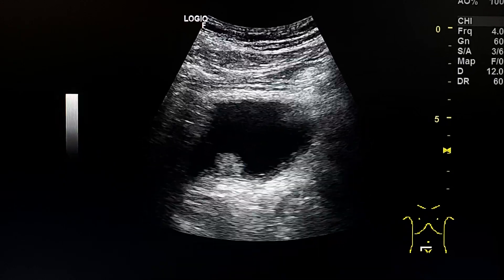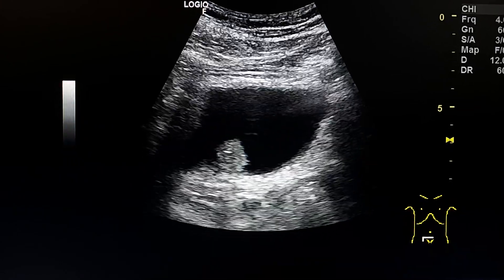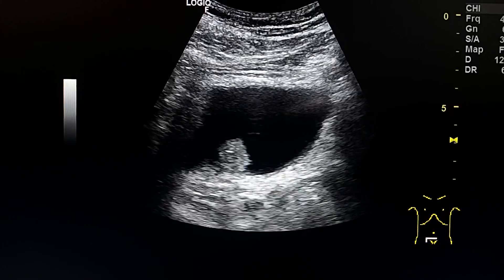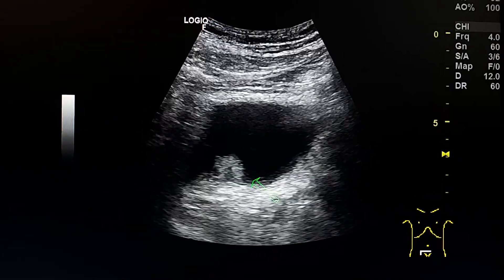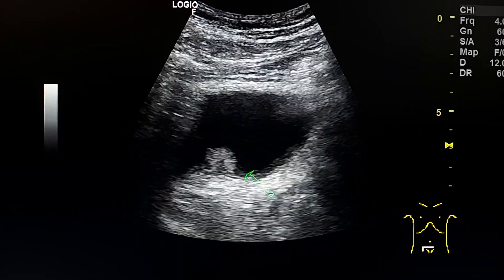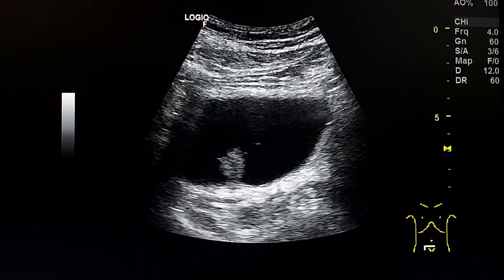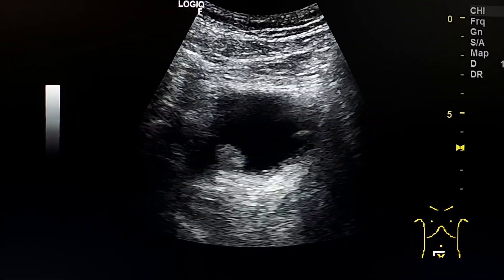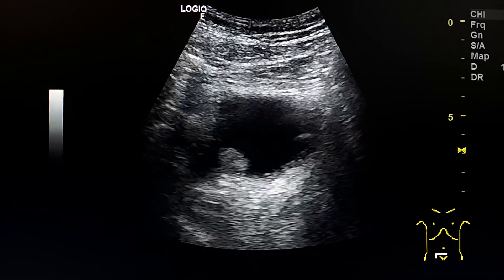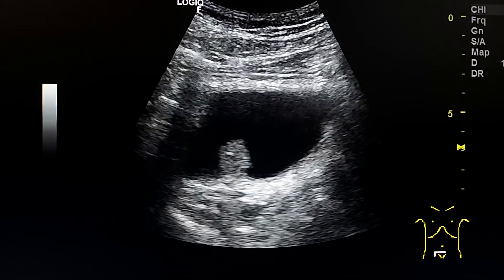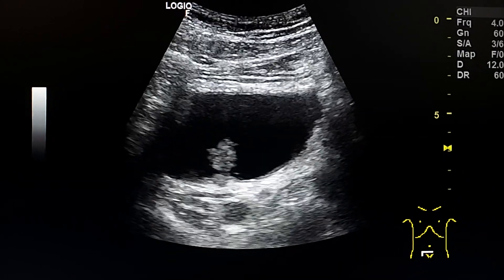This is an ultrasound of the urinary bladder in a 60-year-old male patient who presented with macroscopic hematuria. We see a lesion here which is hyperechoic, located in the posterior aspect. Such a lesion could be a mass from the urinary bladder wall or a blood clot in the dependent portion of the urinary bladder.